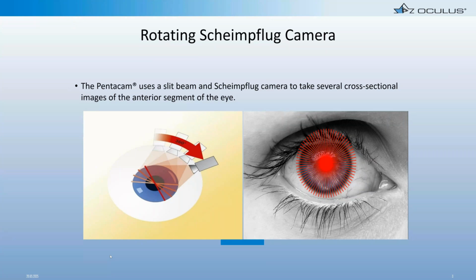And so we're talking tonight about the Pentacam for Ortho-K lens design. I'm not going to say that there isn't application for Placido disc topography in Ortho-K. There absolutely is. But when it comes to lens design, I think you just can't beat the data that you get from a Pentacam, and that's what we'll cover tonight.